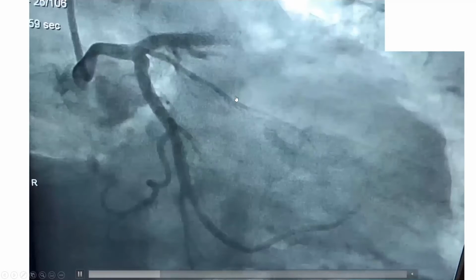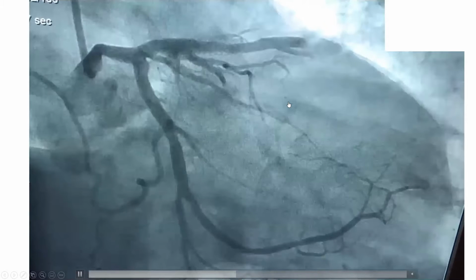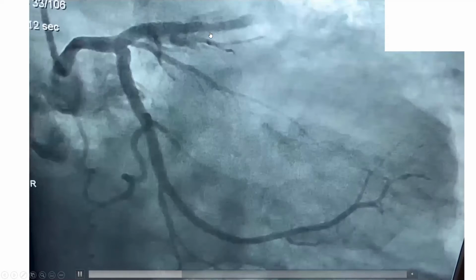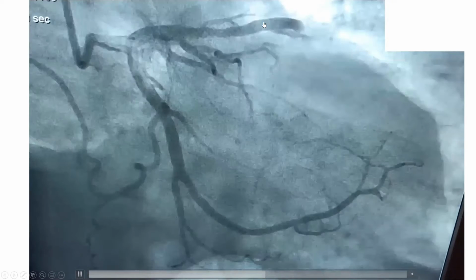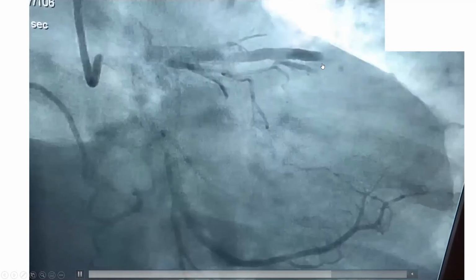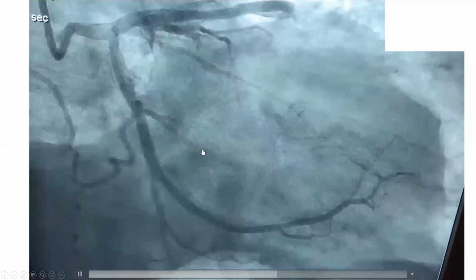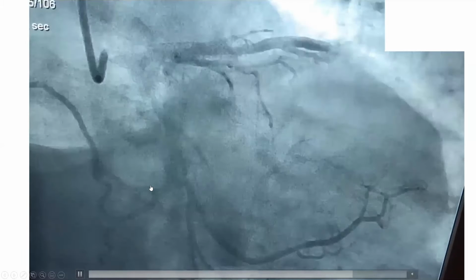There is to-and-fro movement in those branches, suggestive specifically of air embolism. They are occluded with a to-and-fro movement. There is actually involvement also of that high diagonal and of that other diagonal. They are all shut off by air embolism. And none of them stain with dye, which suggests, again, air embolism.